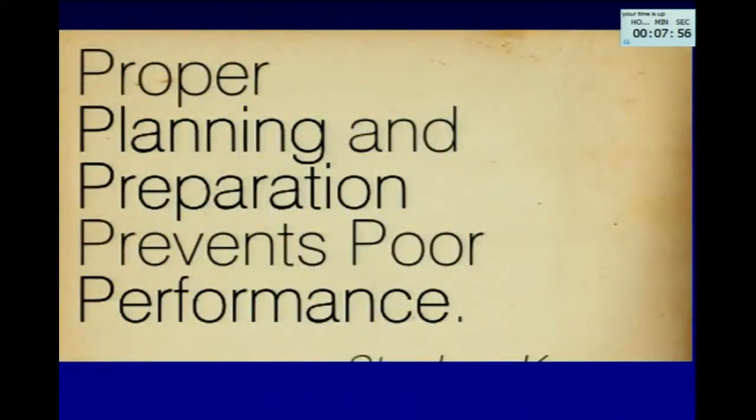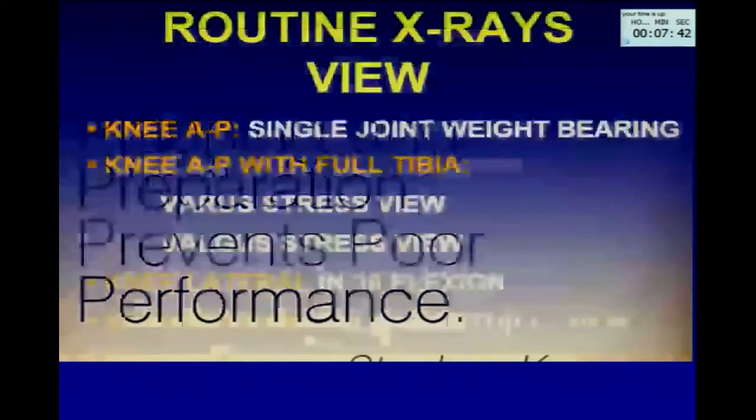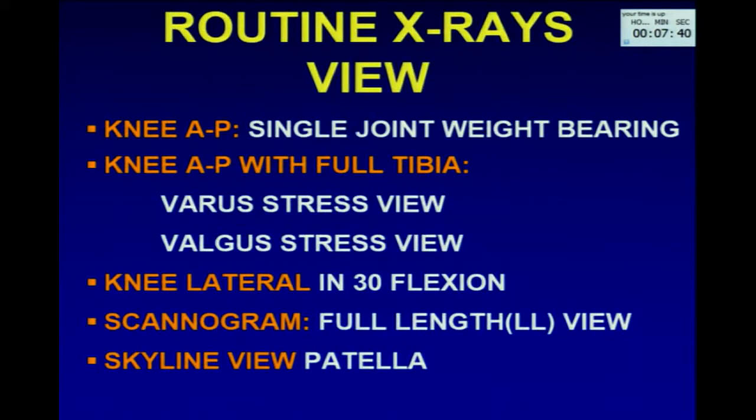So I would like to start my talk with this good quotation: proper planning and preparation prevents poor performance, and it's important in our life also. It's important in every surgery, and TKR is a planned surgery, so you should plan your surgery properly. For that you need routine good X-ray views, and these 5 views are important.